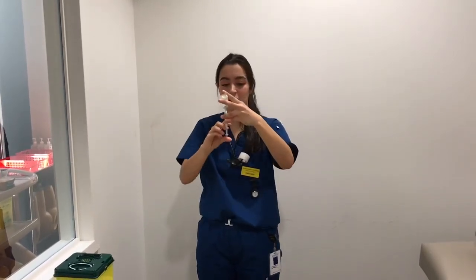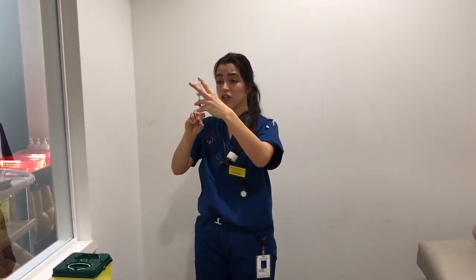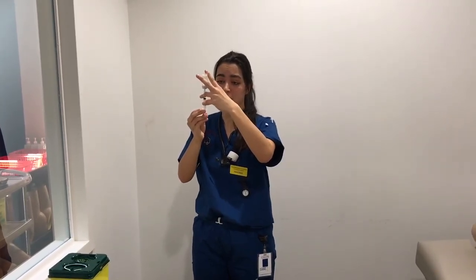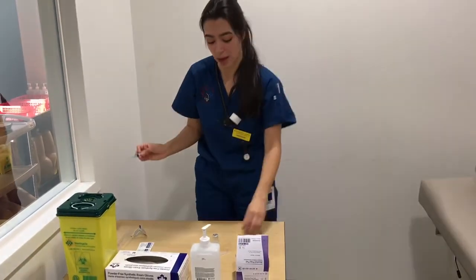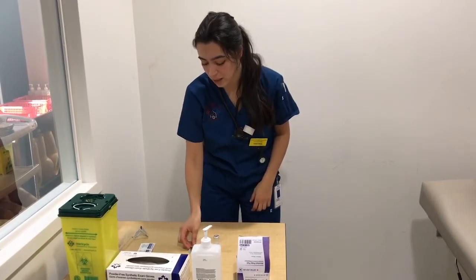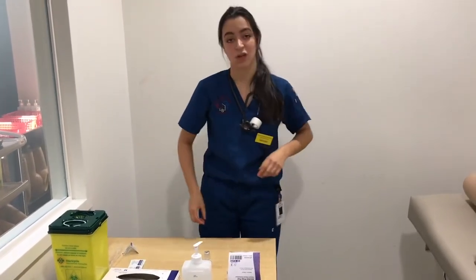And it is okay to push some of the air at the top of your needle back into the vial and then redraw out the correct amount. Again, ensuring there's no air bubbles, placing it down at the counter, taking the needle out and making sure that you are not recapping it with the ends of your fingers. You are putting it against a hard surface and then clicking it on, and then labeling the medication to transfer it to the bedside.